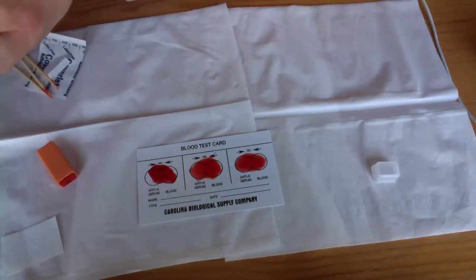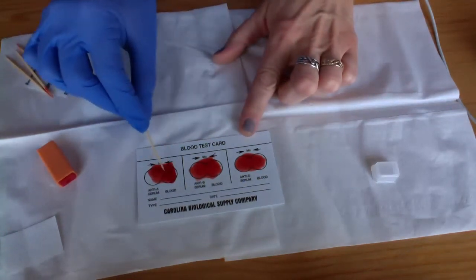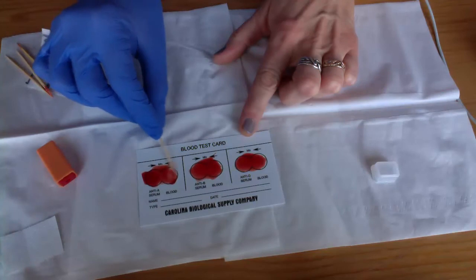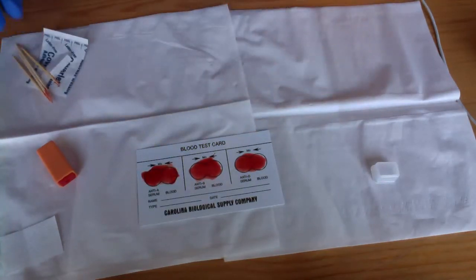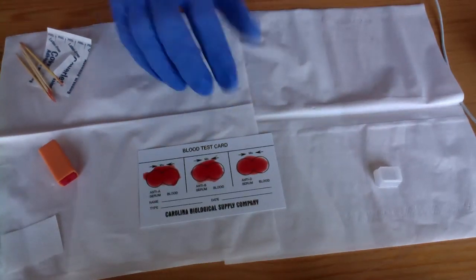And remember, you don't want to cross-contaminate with your toothpicks, because if you cross-contaminate the serums, that will mess up your results.